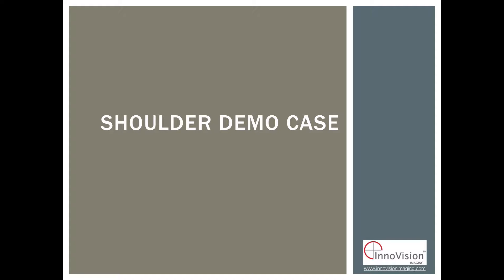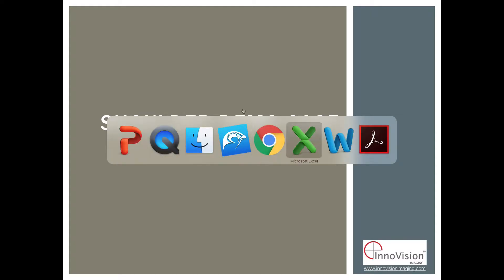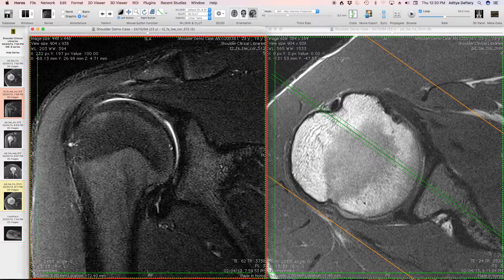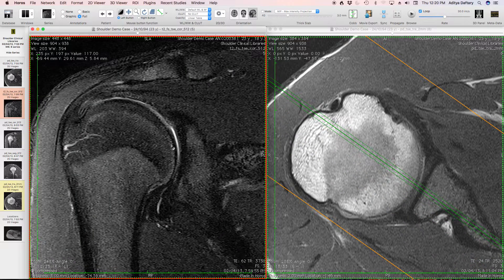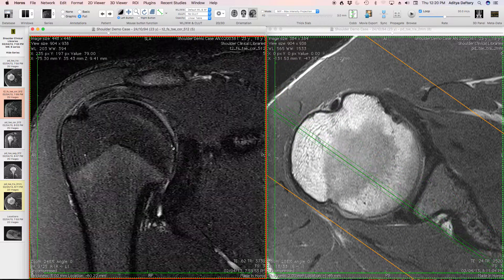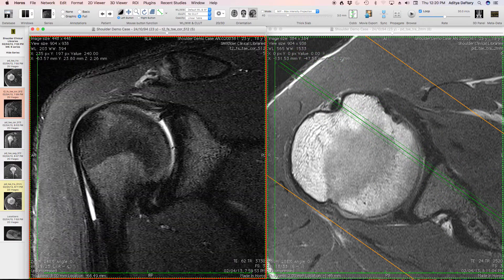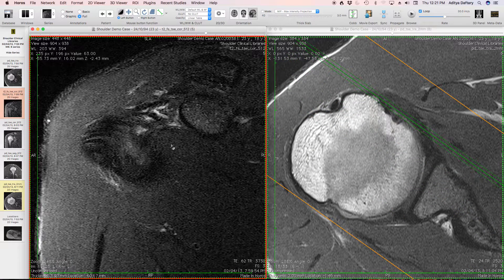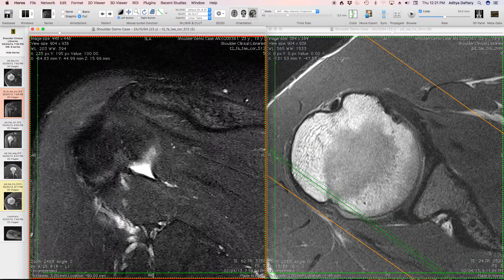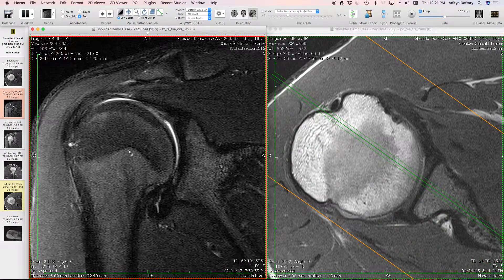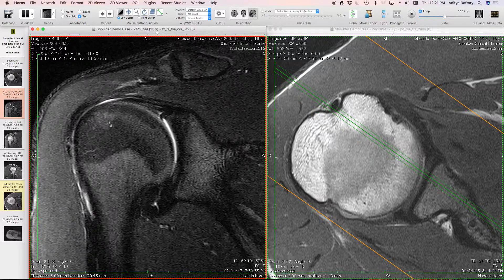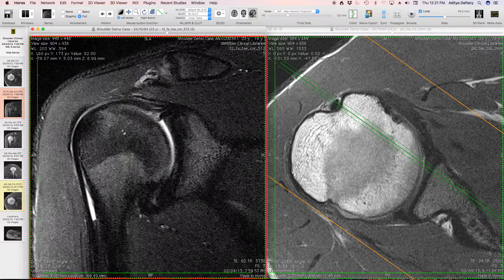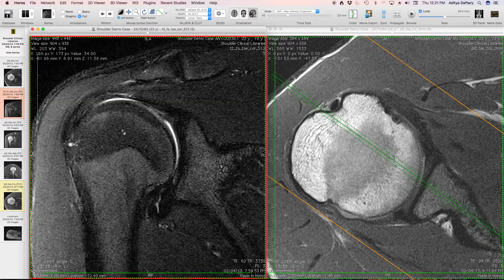We'll start with this first case: a 23-year-old male with shoulder pain. Looking at the coronal fat-suppressed images, we assess bone edema and fluid. There's no fluid out of proportion to what we'd expect. Looking carefully for bone marrow edema from posterior to anterior, there's some subtle anterior superior humeral head bone marrow edema — something we can't quite work out yet, so let's keep that in the back of our heads.